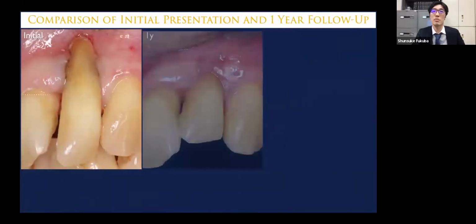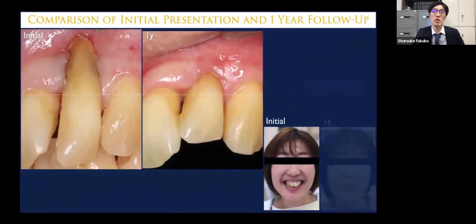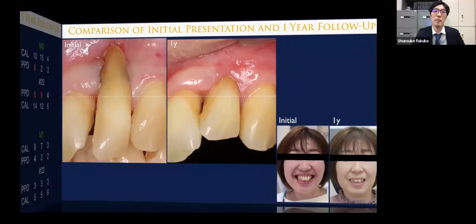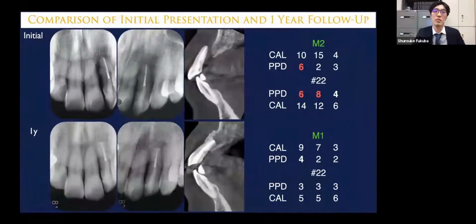When comparing pre-op and post-op images, you can see the improvement of the aesthetics, and the patient was also very satisfied with the outcome. From the CBCT images, radiographic bone fill indicated the prognosis of the tooth was significantly improved after the treatment.